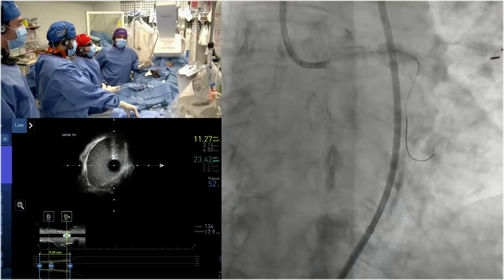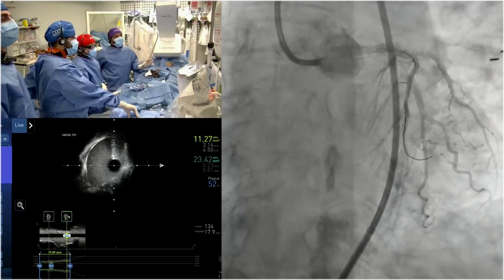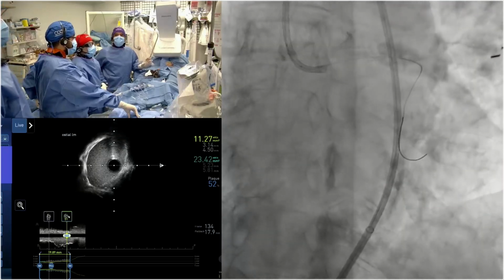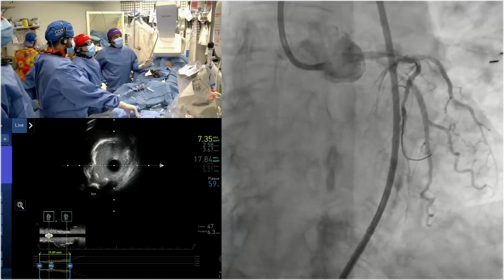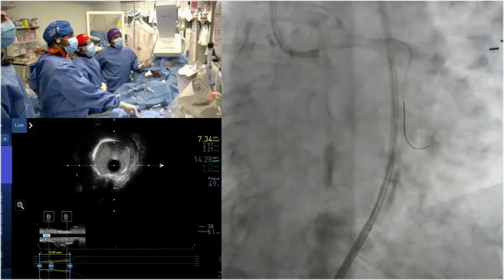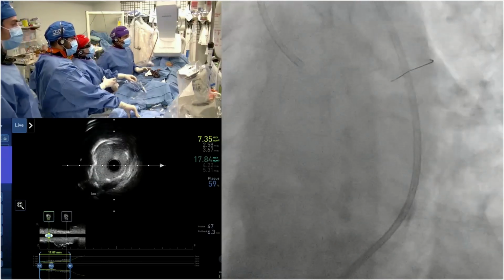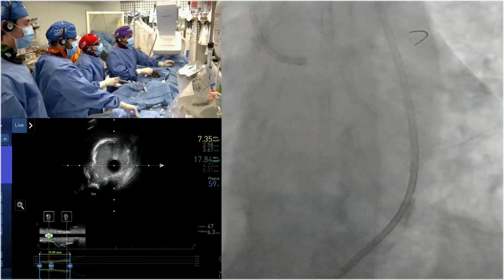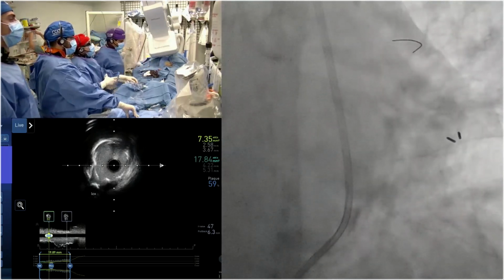This is our last picture. We have shown the IVUS. Tell us about the IVUS. Final MSA of the ostial left main is 11. What is the ostial circ? He's saying the ostial circ is fine, not compromised, so do nothing to the ostial circumflex. I would like to see an angiogram of the ostial circ, a good RAO caudal where I could actually see that circ. I've never seen it. That's where we are.